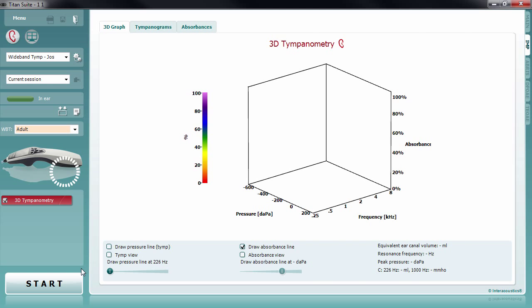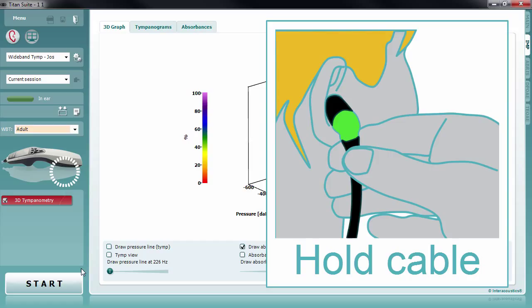In order to avoid probe movements during the measurement, try not to hold the probe. In case you do, try to hold the cable end rather than the probe, as this will least influence the measurement.